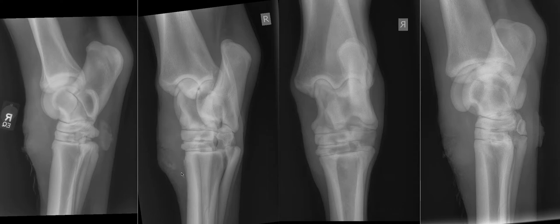Looking at our dorsolateral plantaromedial oblique, the swelling comes quite far around the dorsomedial side of the limb, which we can also see in the dorsoplantar. We can see that dorsal swelling in all of the views. There is a defect in the skin surface — that's where our wound is. So we've got soft tissue swelling associated with a wound and some skin irregularity.